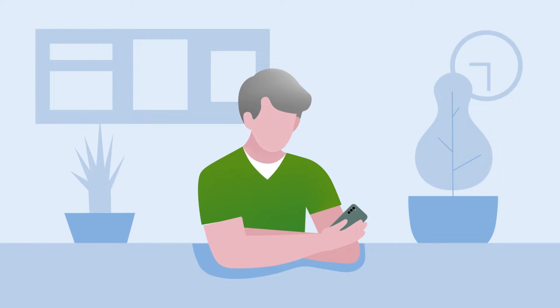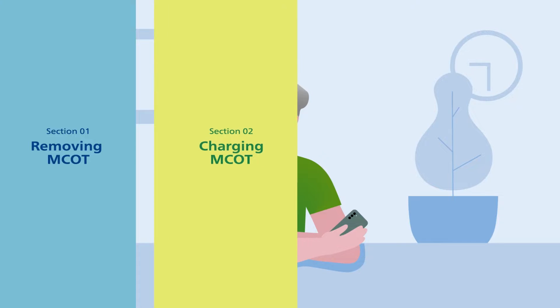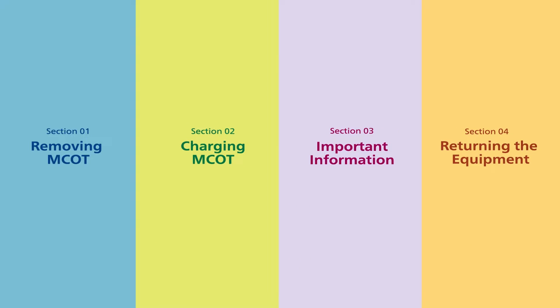Now that you have successfully set up Philips Mobile Cardiac Telemetry, MCOT, this video will provide instructions on how to remove MCOT from your body, how to charge MCOT, other important information, and guidance for returning the equipment.